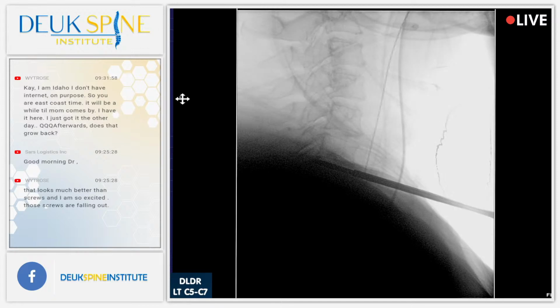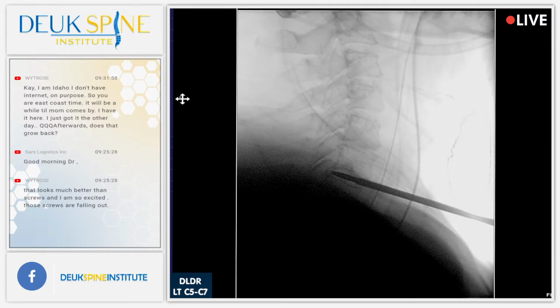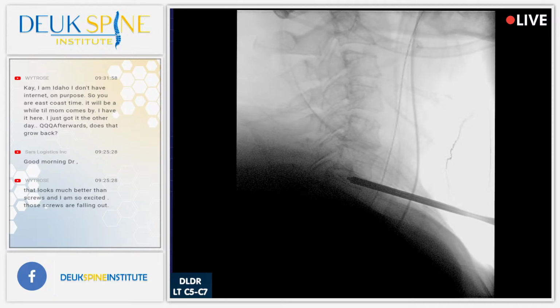All right, we're going to radiate, shot. Is that it? Yes, sir. All right, good. So it hasn't moved again. I'm holding it in place. So the actual dilator, the part that's in the disc near the tear, is getting pushed out. Shot. Oh, there we go. Nice. Great job, guys. Oh, shoot. See that? It literally came out. Show us where it popped back. Can you see that, Henry? Yes, we can. Yeah. And I could feel the pressure.